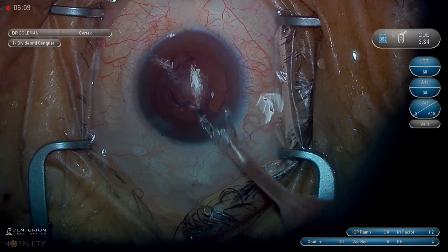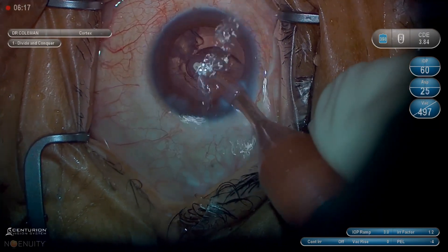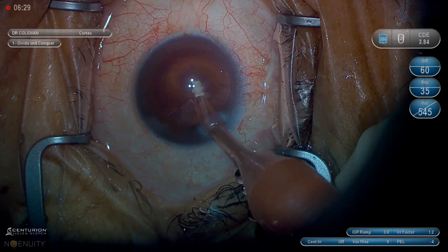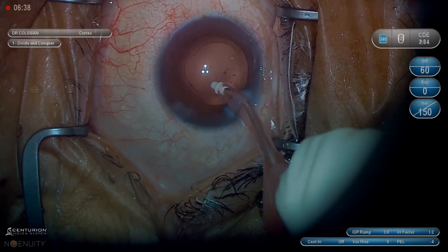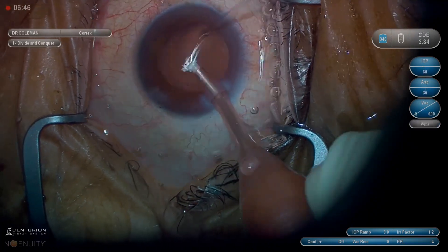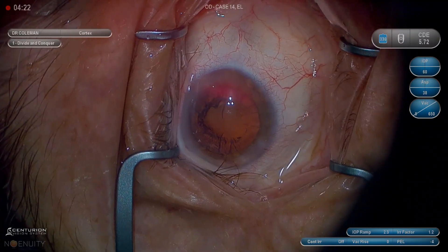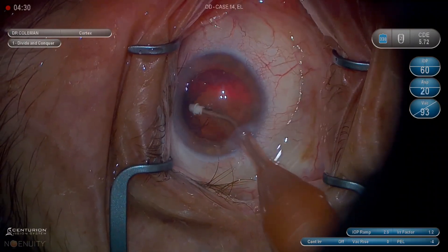As long as I'm in a position where I've got to engage cortex before I engage capsule, we can move pretty fast and be pretty heavy on the foot. When you have the last quarter remaining and you're starting it with clear capsule behind you on either side, that's when you slow down. My initial movement once I engage — moving in an arc and getting a piece — is then to push down posteriorly. It's a U-shaped movement. The cortex attached to the anterior capsule: if you pull it centrally first, you're pulling in the wrong axis. Initially, when it's connected at the anterior capsule leaflet, you want to be pushing down. Once you've separated it out to the equator, then you pull central. Then once you're pulling it up off the posterior capsule, you pull up.